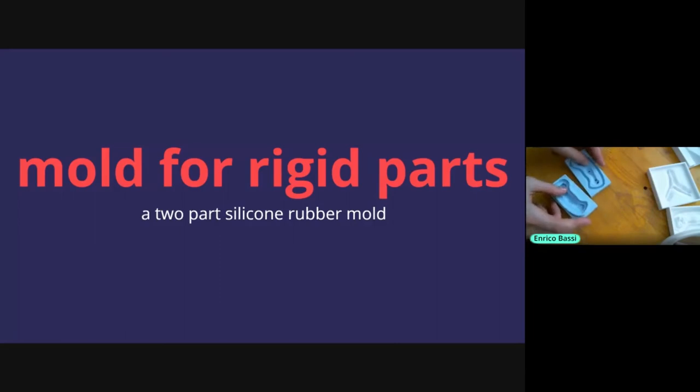So you have two parts. Let me point out some details for you with my big 3D printed pointer. So you have half of the object you want to get in one mold, half in the other. The parting line, it's a surface, of course, is the surface between one half and the other. Then you have some extra features called alignment keys that help to align the border of this and this, plus some holes. One is a runner, so used to pour the material in, and the others are vent holes, so to allow the air out and reduce the bubbles.